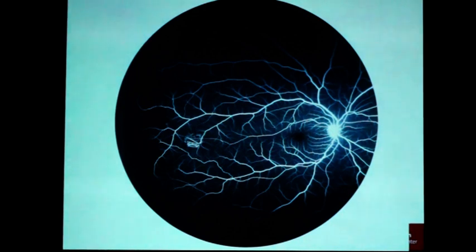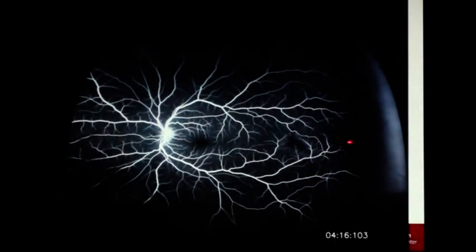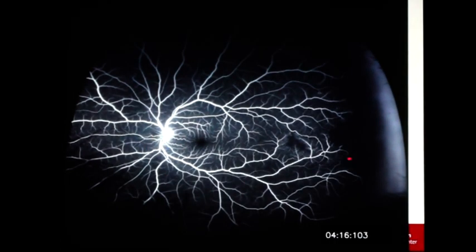But you get your fluorescein angiogram, and it's very clear that you have peripheral ischemia. Okay, can't miss that. But on the color, it's not so obvious. So the value of your fluorescein angiogram in these conditions is very, very important. And the beauty of it is that with this machine, we can get this peripheral view very, very easily. Here in the left eye, where I didn't really see a whole lot, you can see here the dropout.